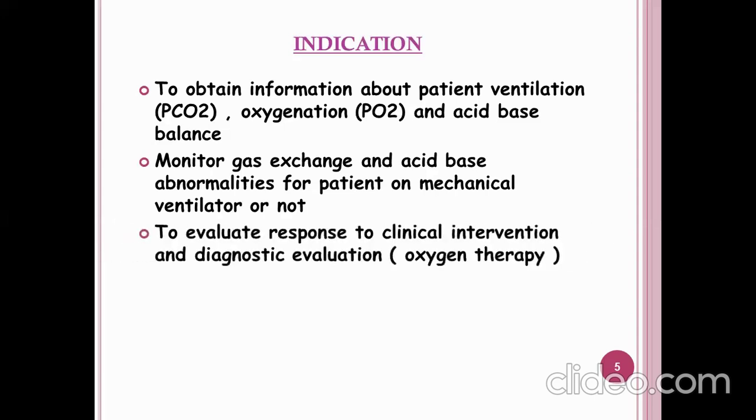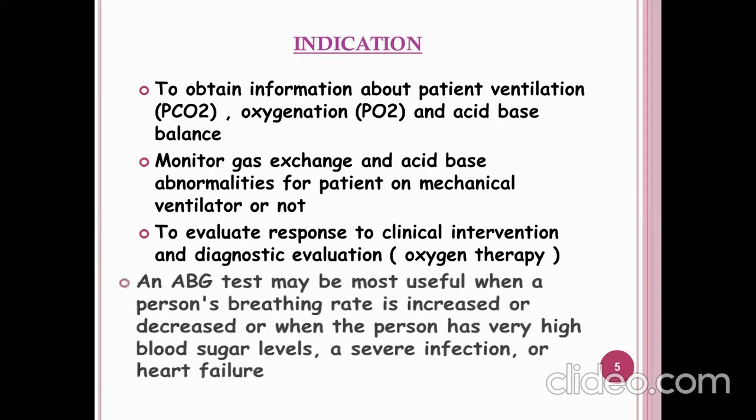Another indication is to evaluate response to clinical intervention and diagnostic evaluation. So that is nothing but the oxygen therapy.